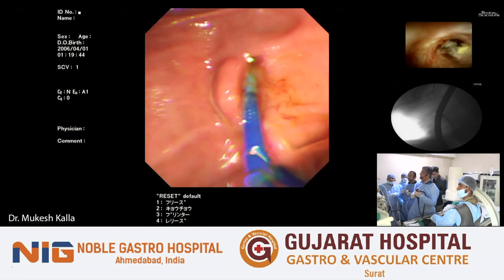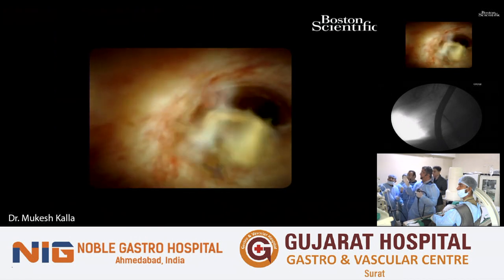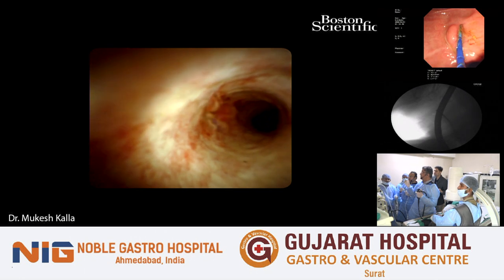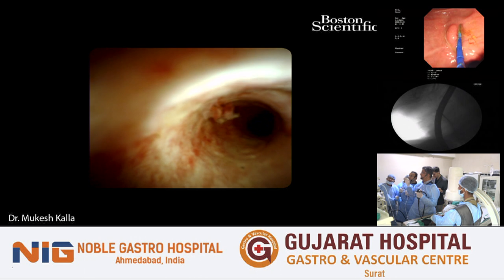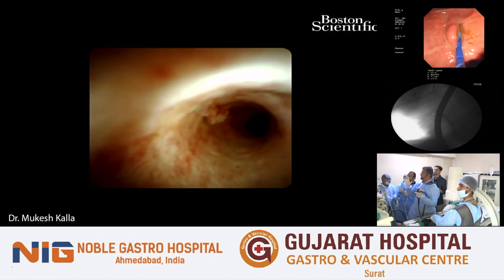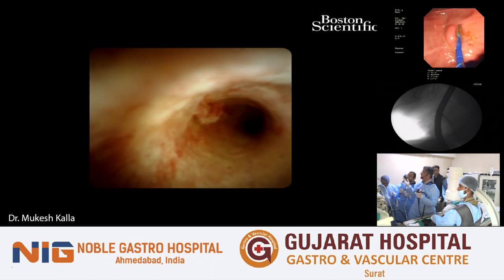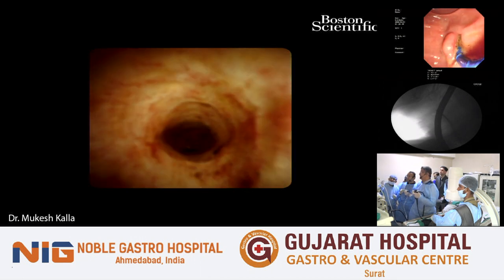Now our intention is we will first go beyond the hilum, go right and left, and ensure that everything is okay. Then locate the cystic duct. Then Somil will probably pass the guide wire under vision into the cystic duct. We inspect the cystic duct, and then we come out. Having done a pan CBD inspection, we are pretty sure that the job is done, so we can come out even without a stent inside.